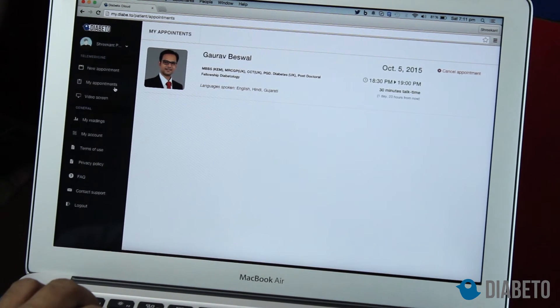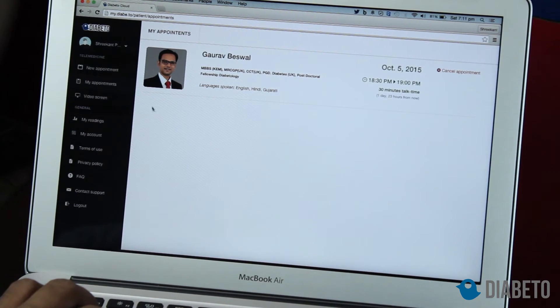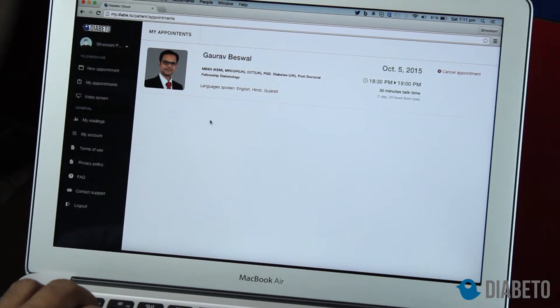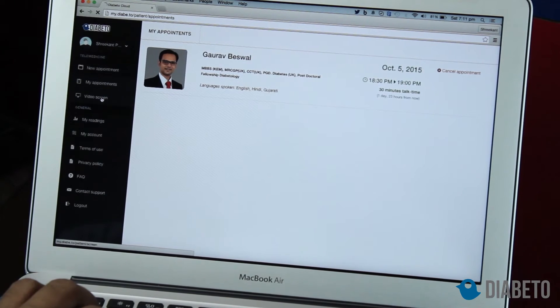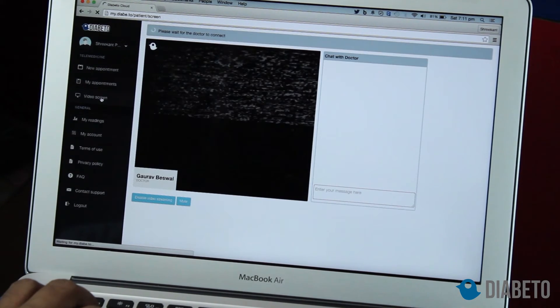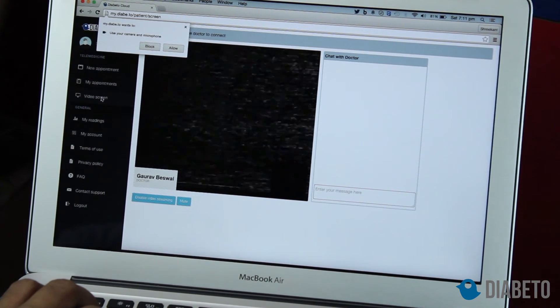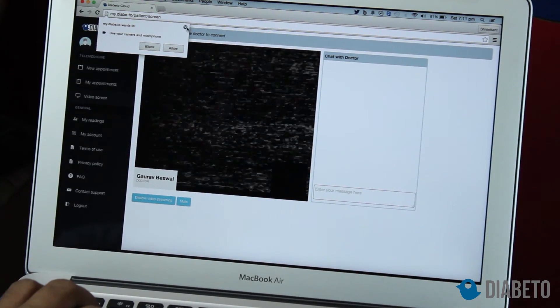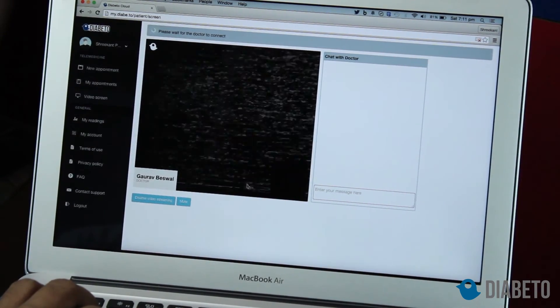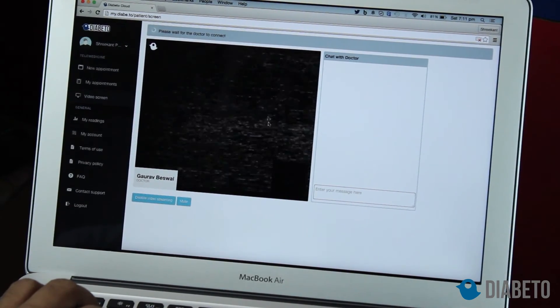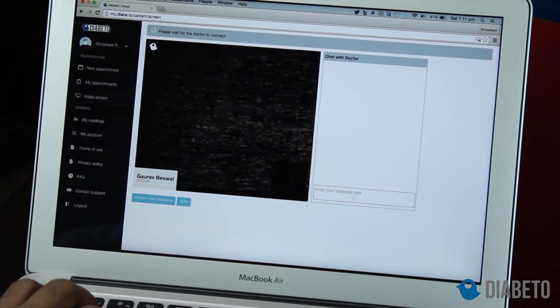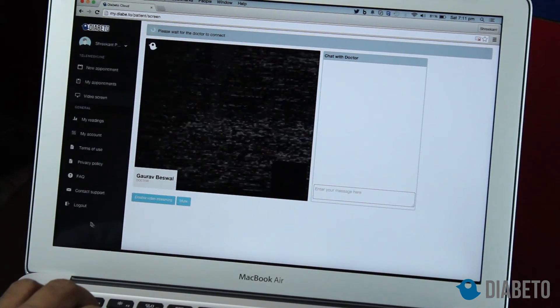Whenever you look at appointments, all appointments will appear on the my appointments screen. It is showing me the appointment I already booked for October 5th. This is where your video consultation will happen — when I allow access, my face would appear here, and when the doctor logs in, their face would appear too. You can also chat with the doctor and take notes.